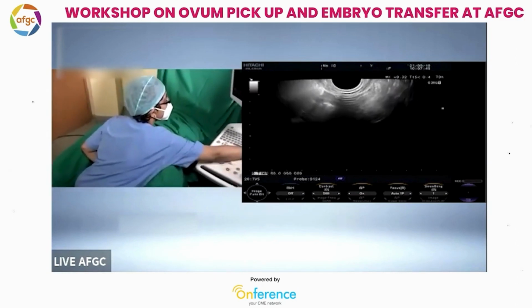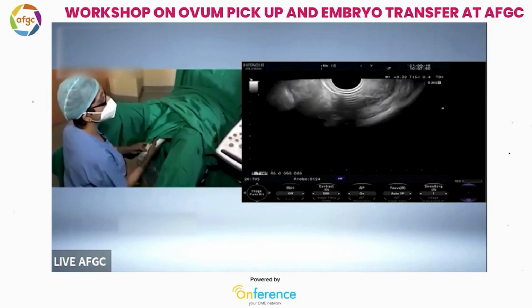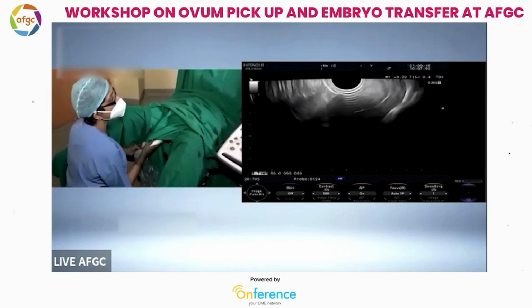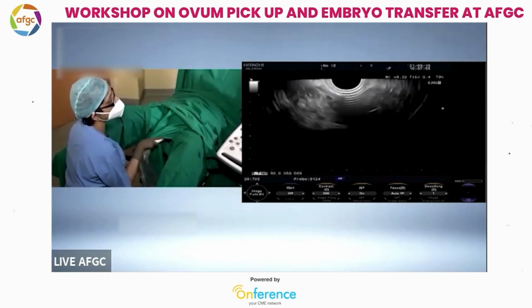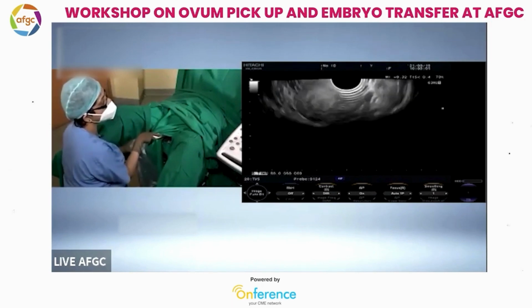So in this patient, we had fluid which I am trying to see, and at least there seems to be a hyperechoic shadow in the middle of the cavity, but there is no specific fluid at the moment.